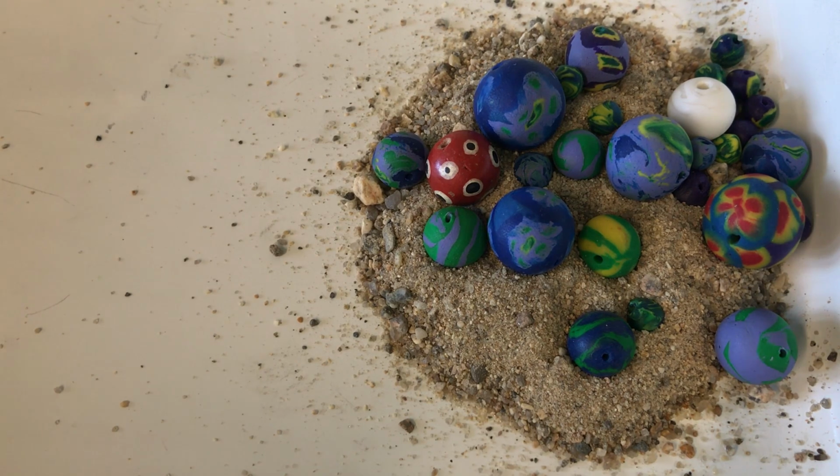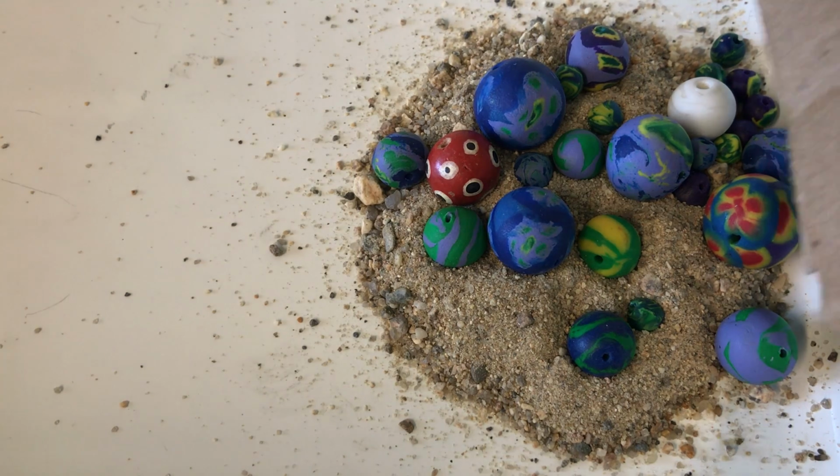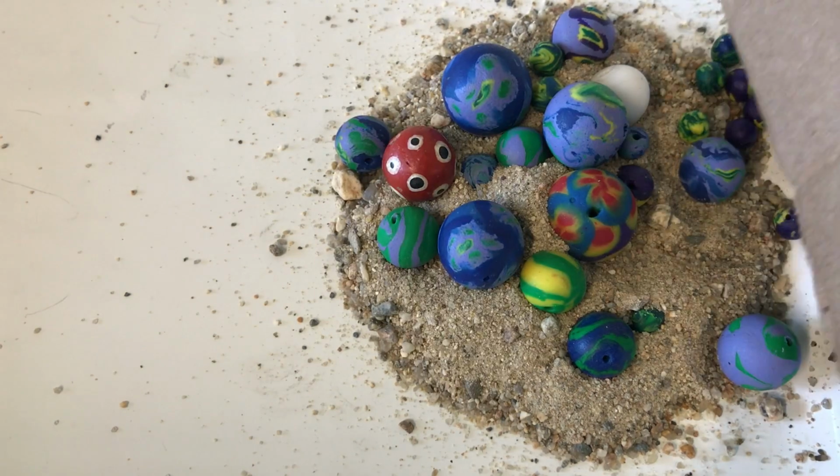So what I'm showing you guys here is a simulation of that, except instead of blood, we're going to imagine the blood is this pile of a mixture of sand and beads of different colors and sizes. And what I'm going to do is I'm going to simulate spreading that across a slide. And we're going to see what happens as we take another piece of glass and we push the blood and spread it across the slide. So I'm going to see how that goes here. Get my slide in there and I'm going to smear it.